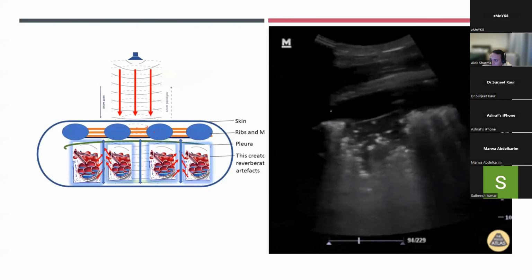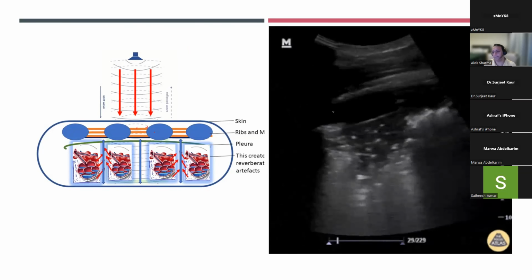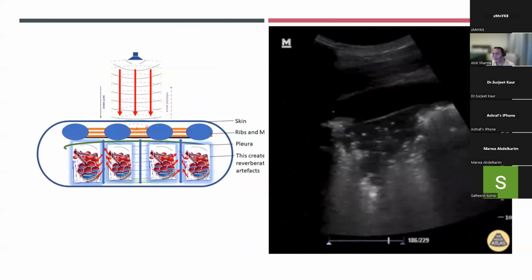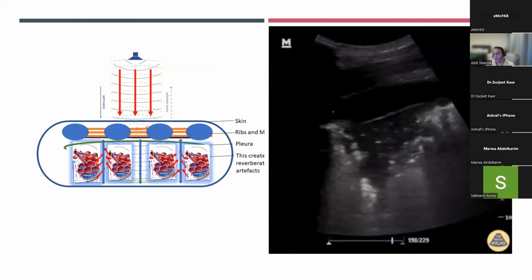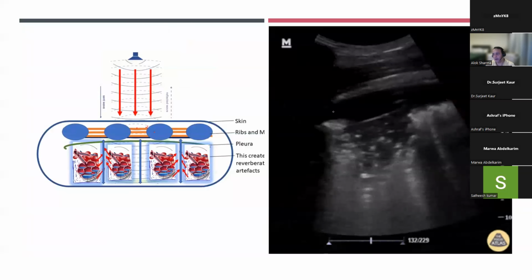Okay? Any other questions? So all lung pathology now depends on the air-fluid ratio, right? Theoretically, yes. Consolidation is a direct image, not an artifact. Yes, in this case, it's the interaction with anatomy which is producing your consolidation.